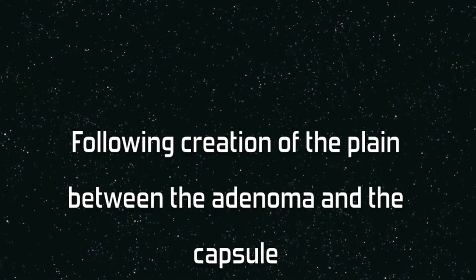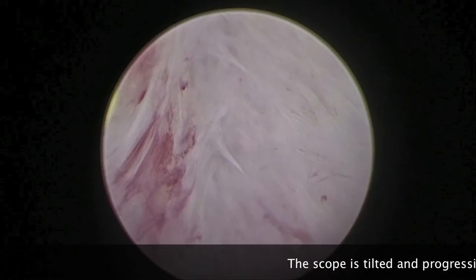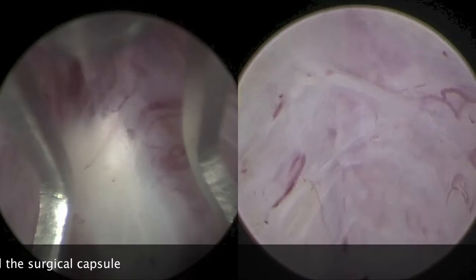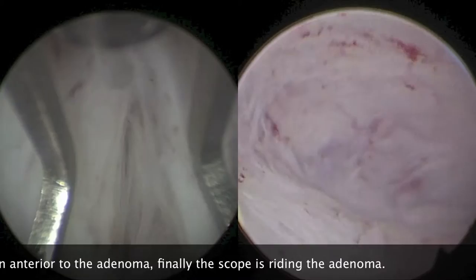After creation of the plane of enucleation between the adenoma and the surgical capsule, the scope moves in two dimensions: the bladder neck side movement and the rotating movement following the adenoma contour. The scope is tilted and the dissection continues laterally between the adenoma and the surgical capsule. Progressive dissection following the contour of the adenoma is continued anteriorly, and finally the scope is riding the adenoma with the roof of the dissection being the surgical capsule.